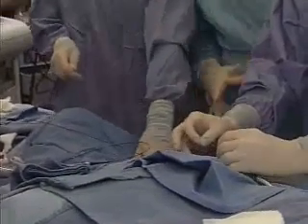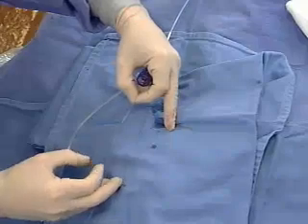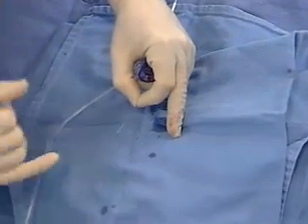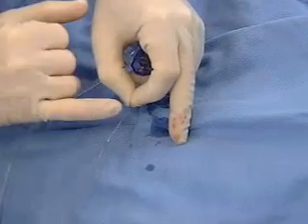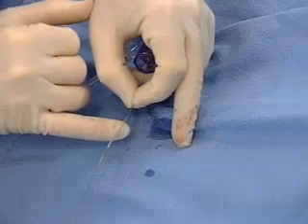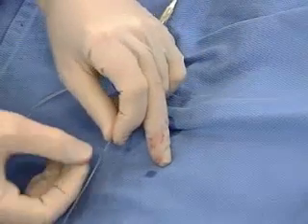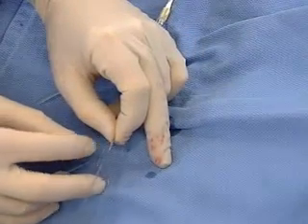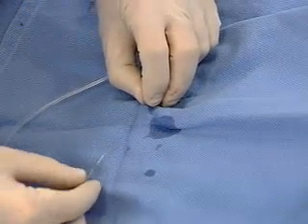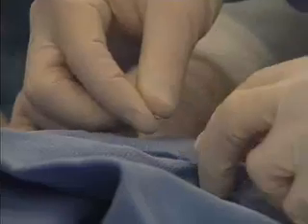And Dr. Lauer is one of our experts in intravascular ultrasound. Dr. Campbell, why don't you show us the camera? This thing is quite remarkable. It's less than a millimeter. The camera, we slid it over the wire, so the wire goes right through the middle of the camera. This is a guide marker for the very tip. The camera itself, I shouldn't have really said it went through the camera, but near the camera. The camera itself is this marker. And we're using this to judge the length of the lesion, basically the size of the vessel. So I'm going to slide that camera down this wire now.